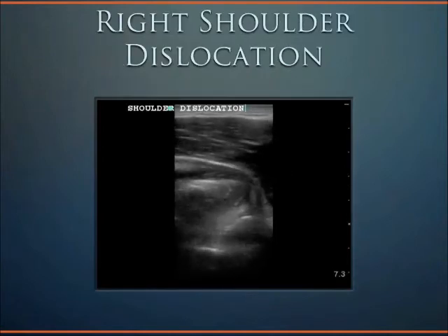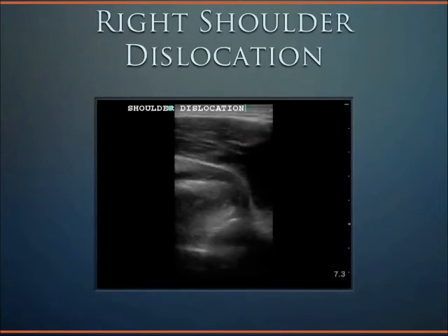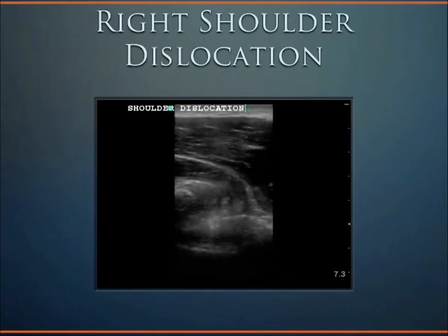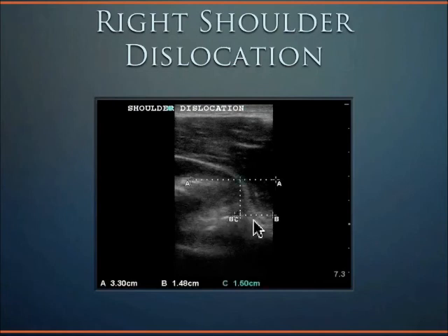This is an example of a shoulder dislocation. This is a right shoulder, but this time one can see the humeral head is actually quite anterior compared to the glenoid. Here's the glenoid, and here's the humeral head in an anterior dislocation. The distance is 1.5 centimeters.